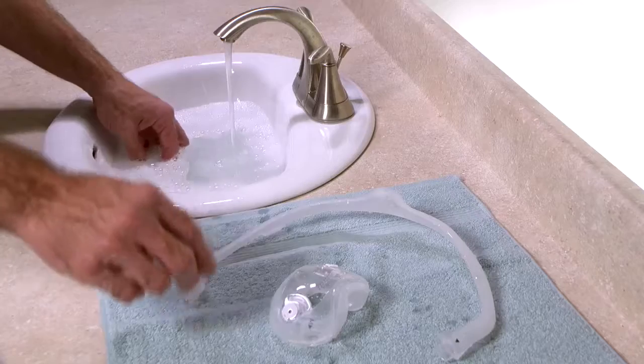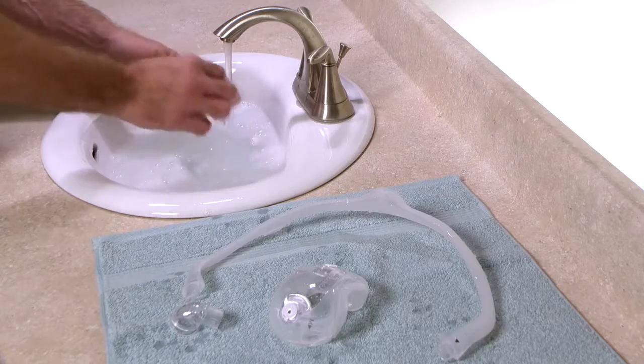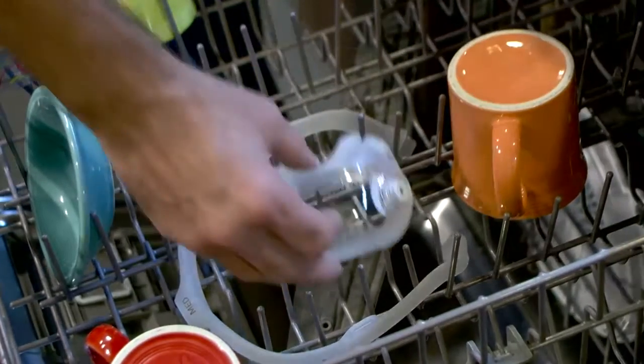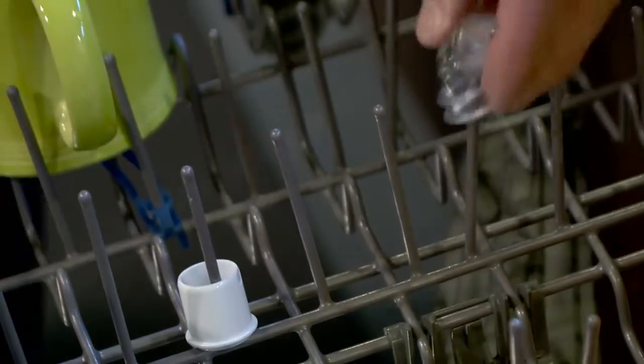Rinse the clean parts thoroughly with water and let them dry completely before use. In addition to hand washing, you can place the mask on the top shelf of the dishwasher for cleaning once a week. Choose mild detergents and use the air-dry cycle.